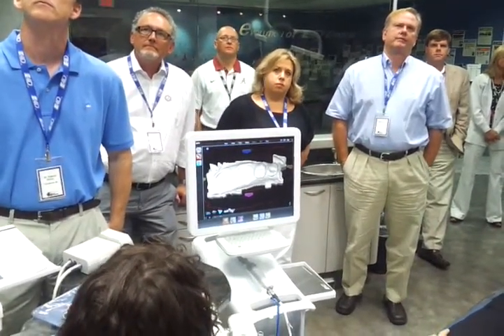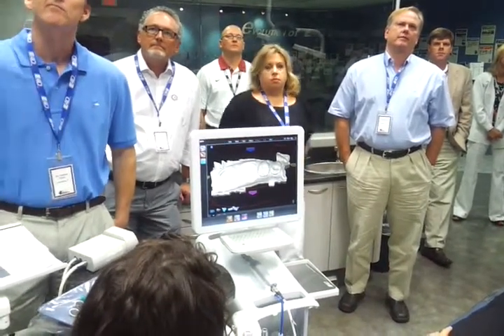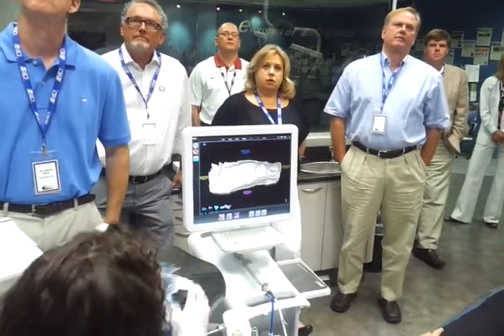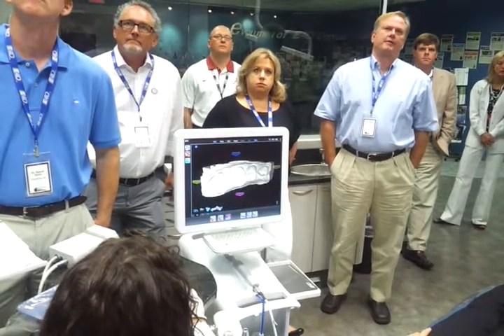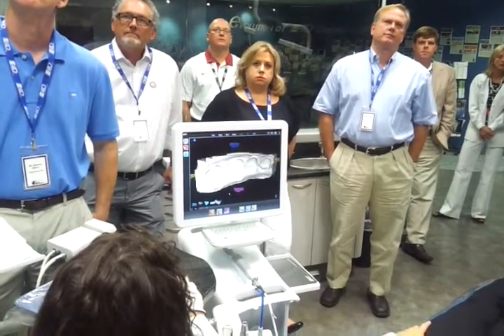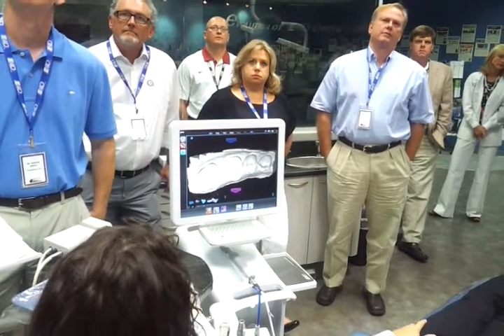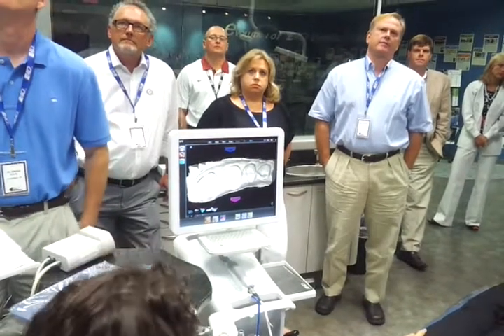And what the system is doing now is going through my scans that I captured, and it's going to remove this data. After that data is removed, I'm going to move on to the bite. For time's sake, what I've already done is actually taken the bite on Gary and I've scanned it in. I'm just going to trim this little piece right here too because it's close to my margin. So I'll show you what that looks like and then I'll show you what you need to do.